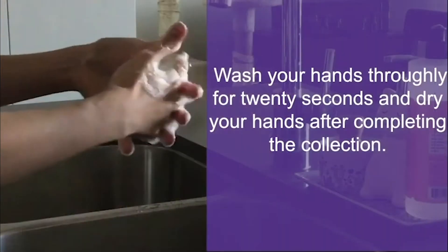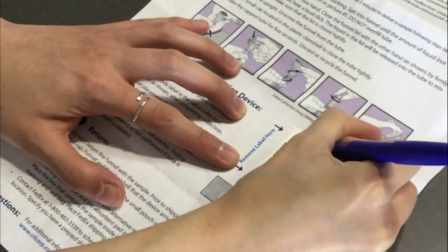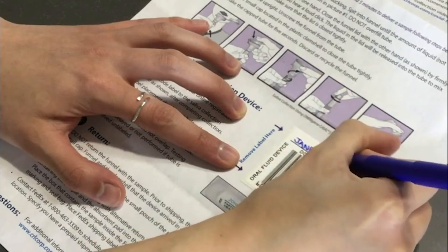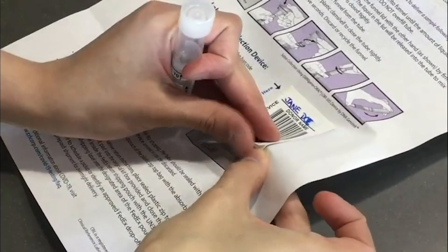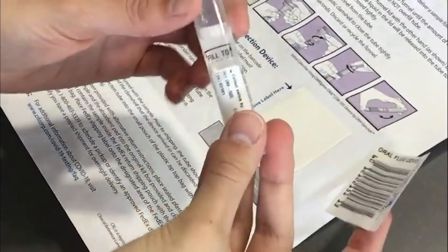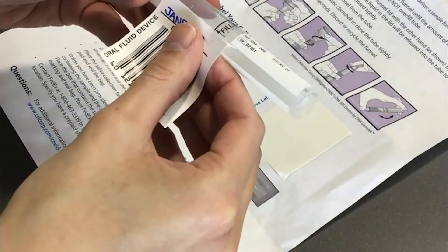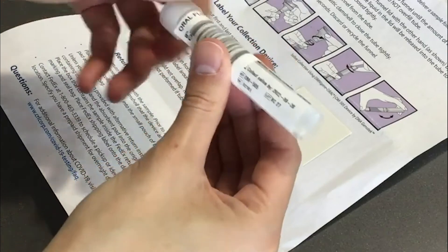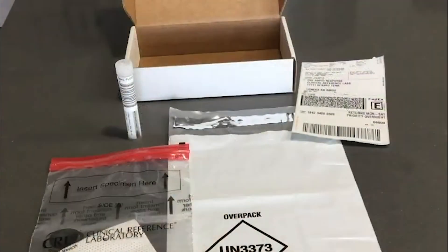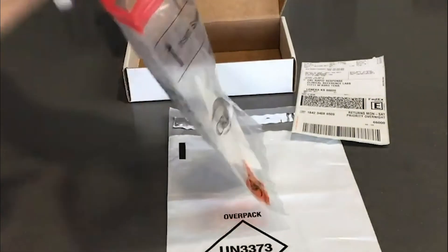Wash your hands thoroughly for 20 seconds and dry your hands after completing the collection. Write your first and last name on the barcode label. The name on the barcode label must match the name on your online registration. Affix the barcode to the saliva collection tube; label placement should start below the cap with the barcode number running down the tube. Place the saliva tube into the plastic zip-top bag with the absorbent pad and seal the bag.